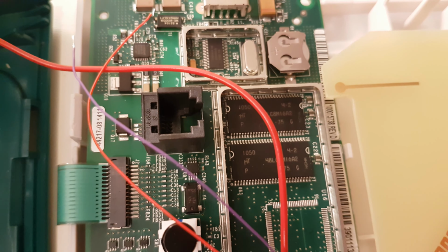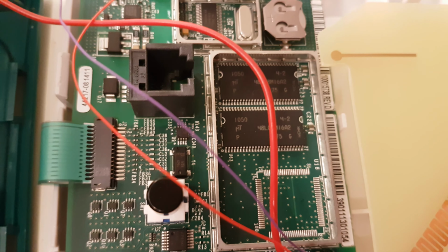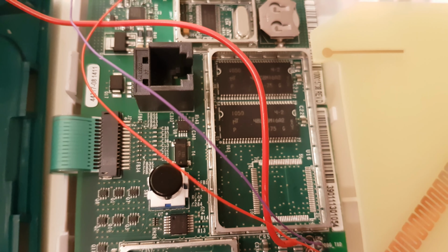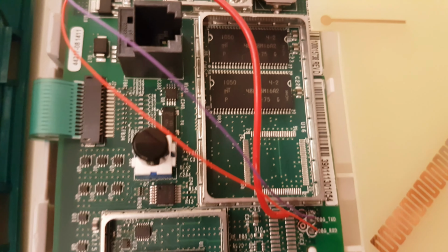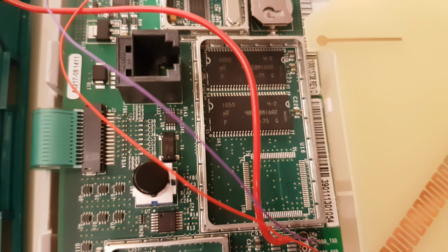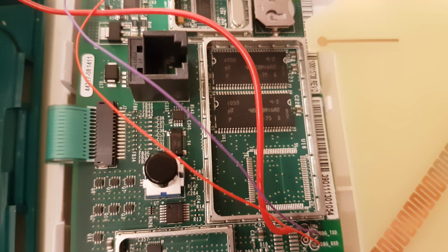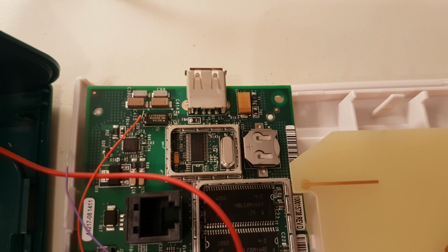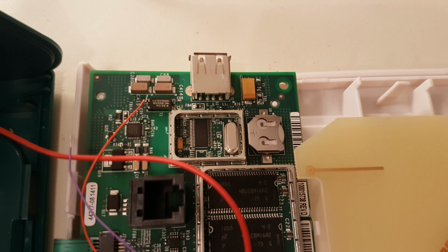We've also got a phone jack here, just to the left of the RAM. That is one of the three ways that this thing can call home to report back. It reports back the statistics of the pacemaker. So telephone is one. You can also get a USB adapter that is wireless or Wi-Fi or a SIM. So it can do cellular as well.